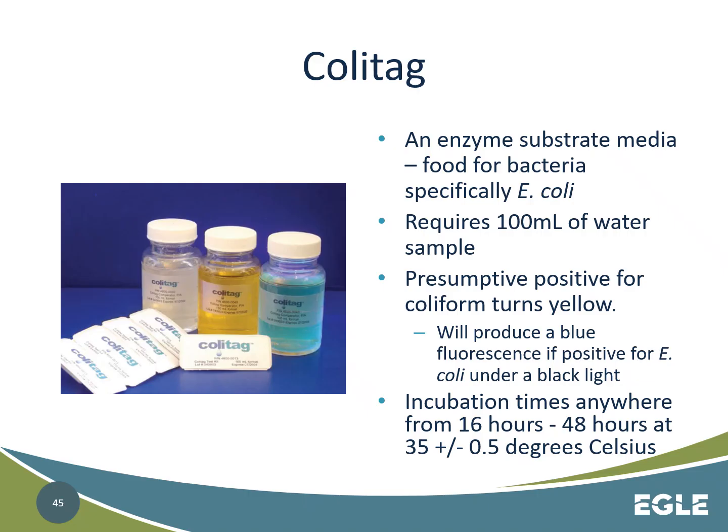So the reason that this can be read at 16 hours and not 24 is if you choose to pre-warm the sample. The procedures for that can be found in the test, but if you take the sample, inoculate it with the powder, and then place it in a hot water bath, I think for up to 30 minutes, once it's in that water bath, you can accelerate the time that it takes to read whether there's coliform bacteria in it at as little as 16 hours. It is the fastest method on the market, so to speak.